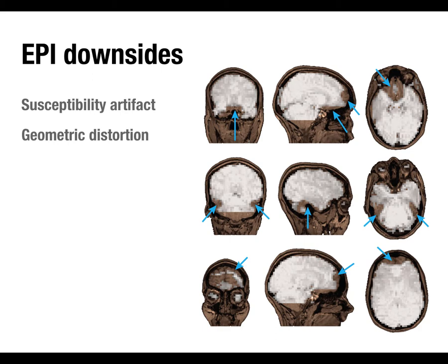Mostly, the issue is that these sorts of things are missing data, right? So if you correct, all you're doing is warping the data that you do have to match the way the brain should look. You can't recreate data that wasn't there in the first place. So it helps more with aligning the functional images with the structural images, rather than allowing you to image areas that would otherwise be difficult to image. There's more engineering that's required to do that imaging.